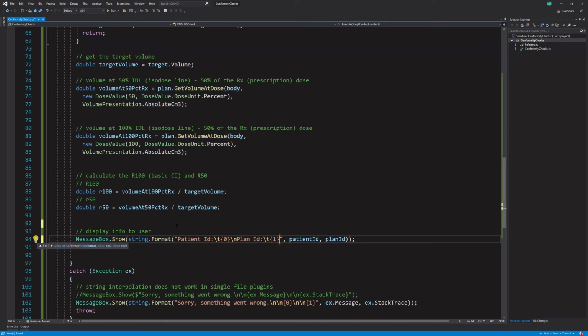Okay, so let's do a new line again, and let's actually add a couple, and give a few statistics. Let's do the max dose, and let's do a tab, and let's give it in percentage. Because sometimes we do 50 gray, sometimes 48 or whatever, it doesn't matter. But sometimes it's just easier to think of it in percentage, because maybe your doctor wants it less than 135, or maybe they want it at least 150. Remember, this is a really high dose in a short number of treatments, so the whole point of it is to be hot. So we know this is going to be 2, and let's add some formatting.